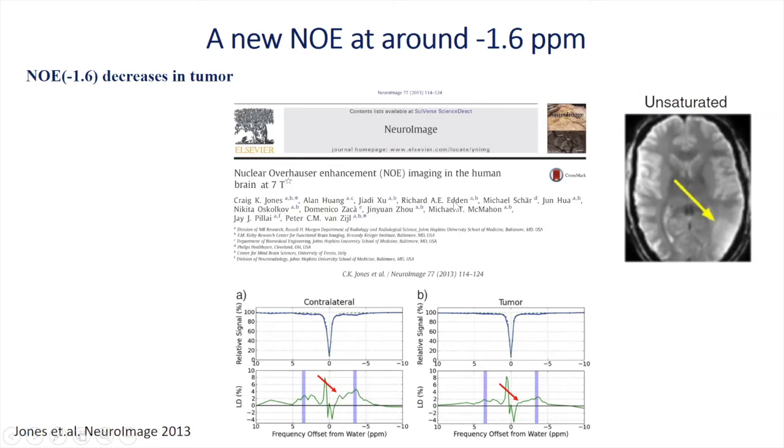But in this publication, they only report the study on the NOE at minus 3.5. The NOE at minus 1.6 was not noticed in this publication.